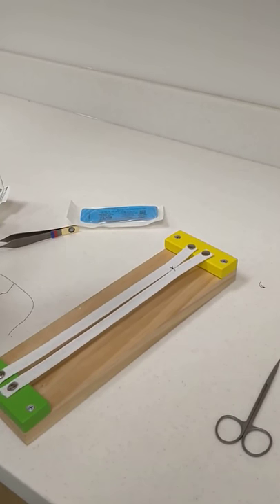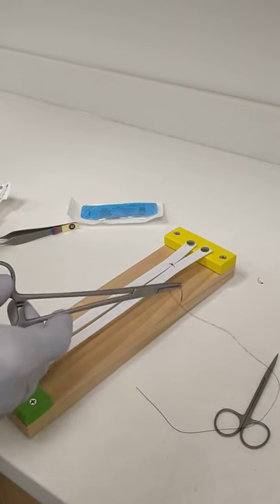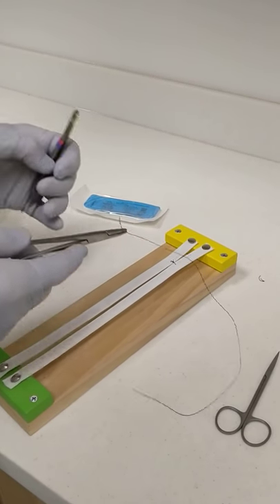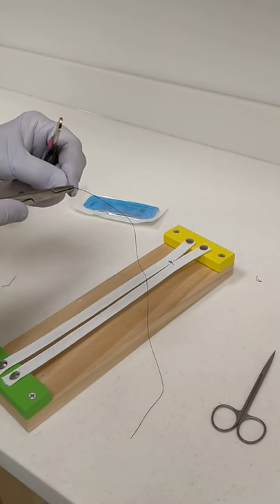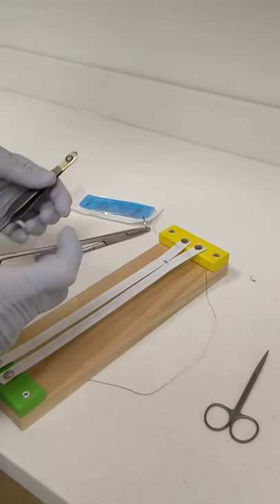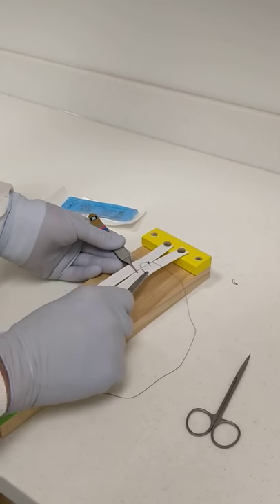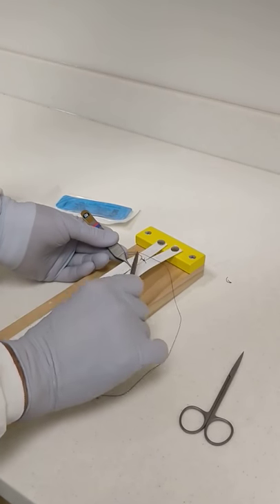You're also, when you're doing an entire quadrant, going to want to run your suture. And there are different types of running sutures. The easiest and probably least used is a baseball stitch.